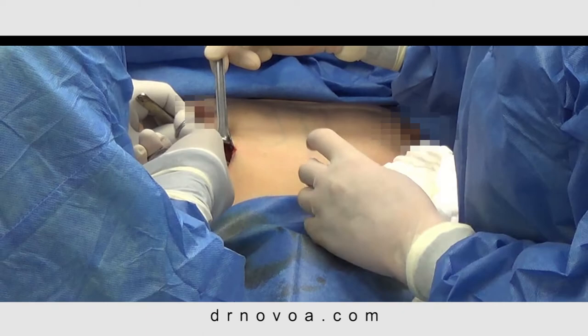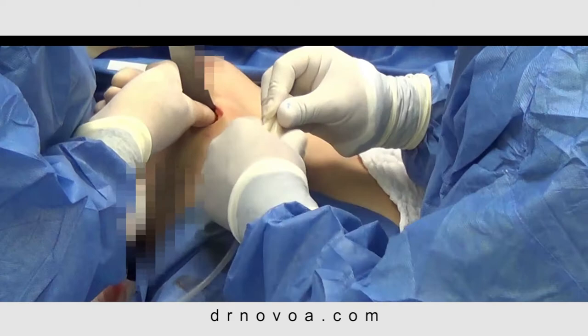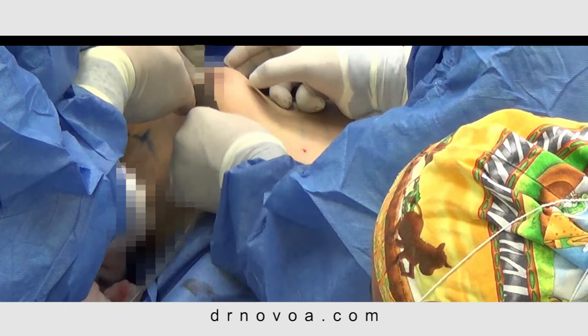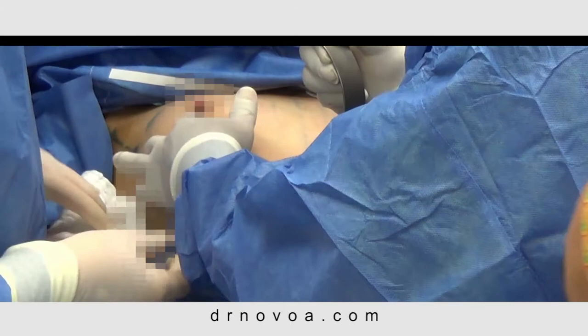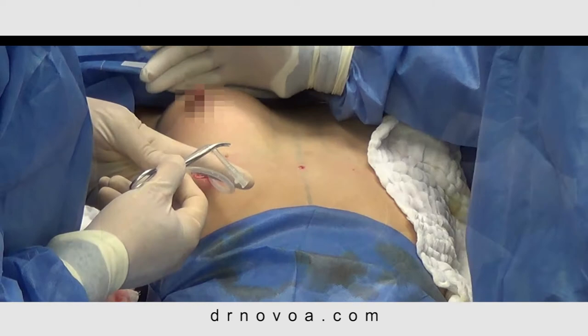Sharp and blunt dissection allows for the undermining and lifting of the pectoralis muscle and creation of the submuscular implant pocket. The implant sizer is then inserted. The sizer is then inflated to the desired size. The same procedure is done on the opposite side.